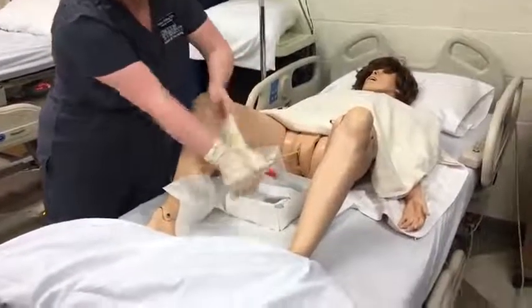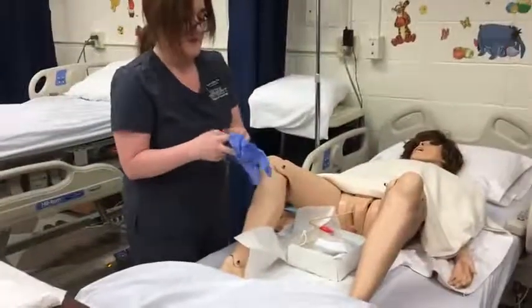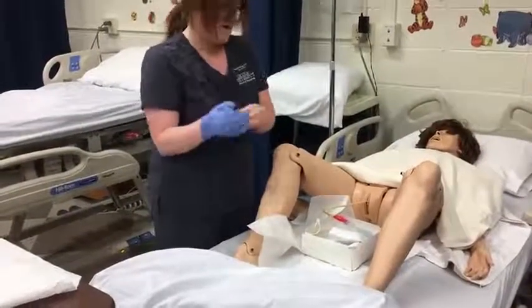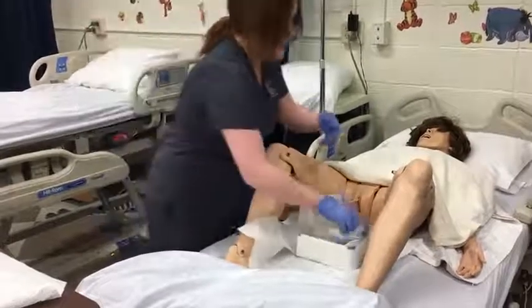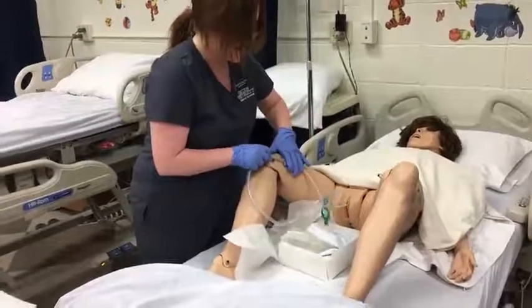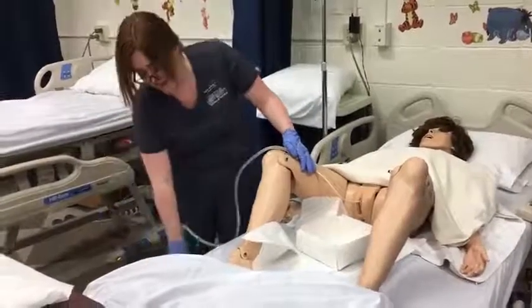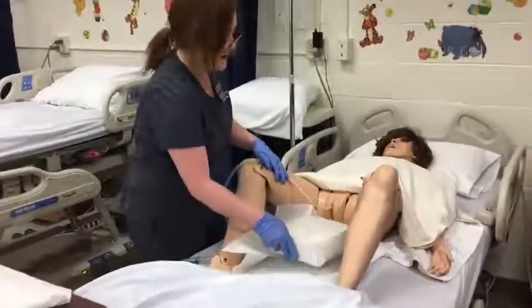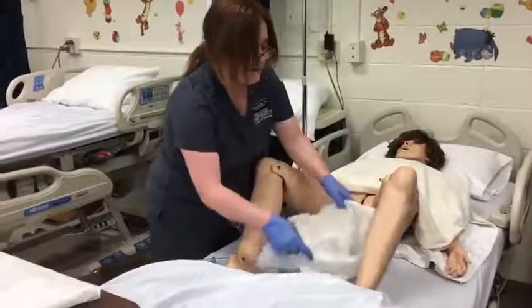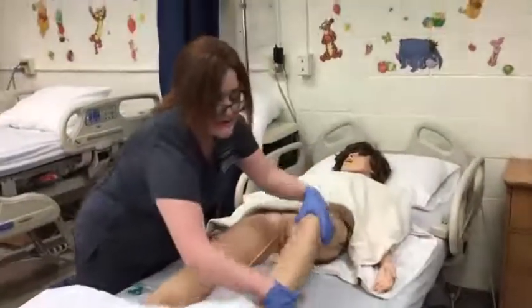I'm going to remove my gloves, perform hand hygiene, and put a set of plain gloves on in order to help the patient reposition and to properly secure the catheter to the leg. You want to attach it about here to the inner thigh so that there's enough give that you're not pulling on the catheter. And you want to hang the catheter down on the side of the bed where it is below the bladder so that it can drain properly. Once I've secured that, I finish discarding all of this and help my patient into a comfortable position.